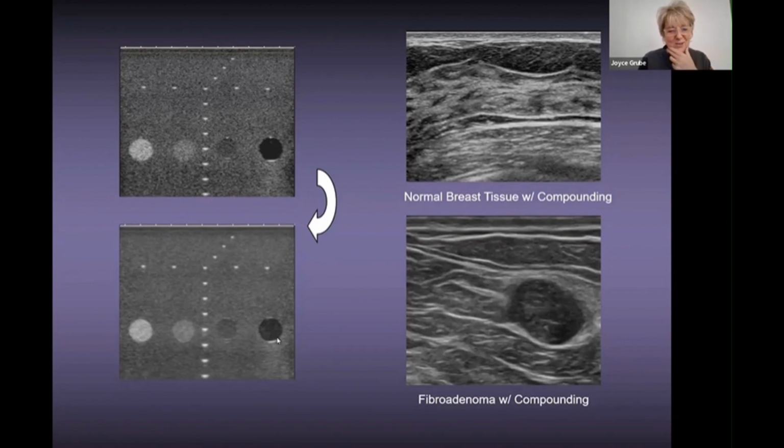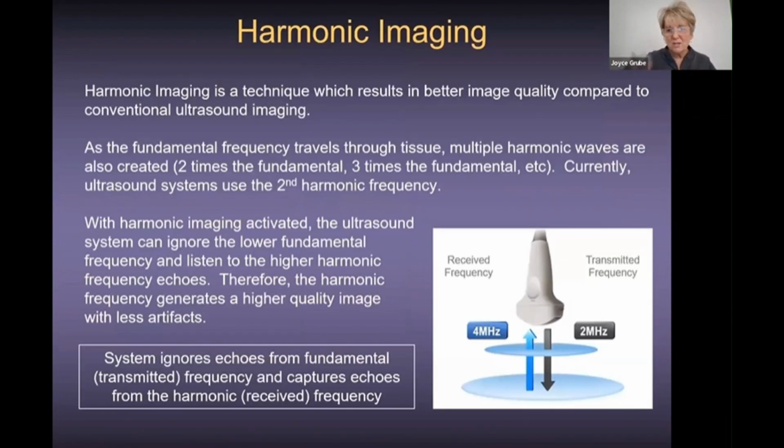That's exactly right. You don't like it when your cysts become filled in. So that's just something that you're going to have to battle with. That's going to have to be a balance. You're going to have to find that level of spatial compounding somewhere in the middle where you still have good diagnostic markers.